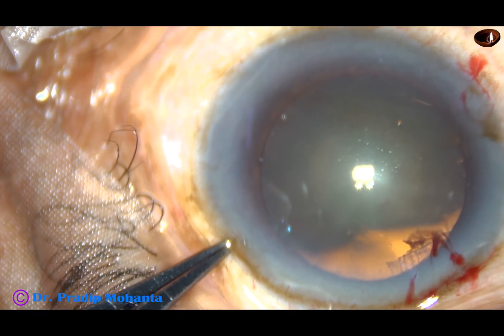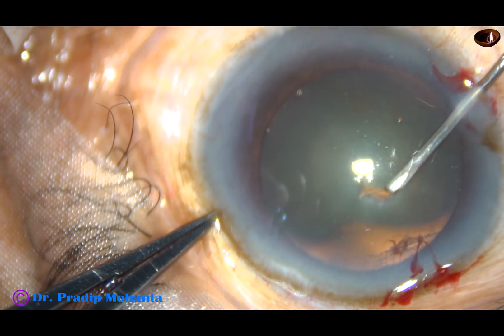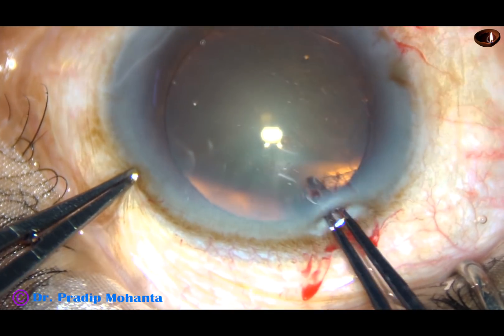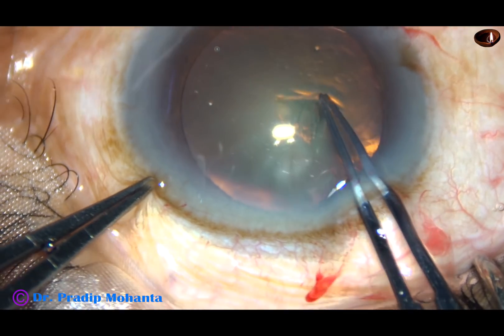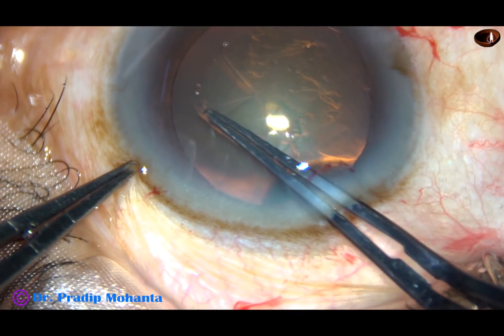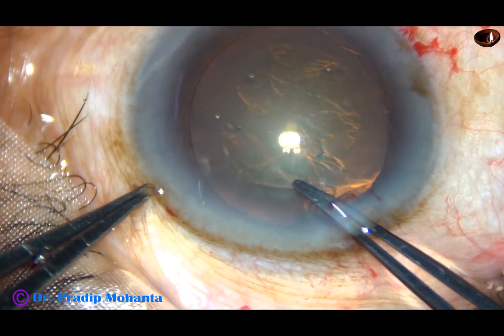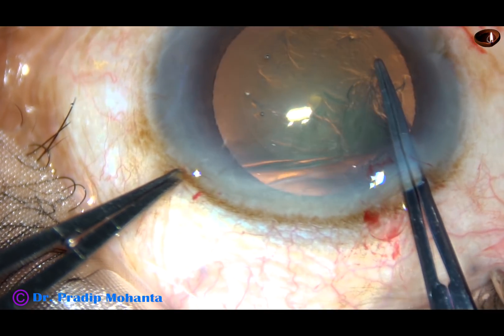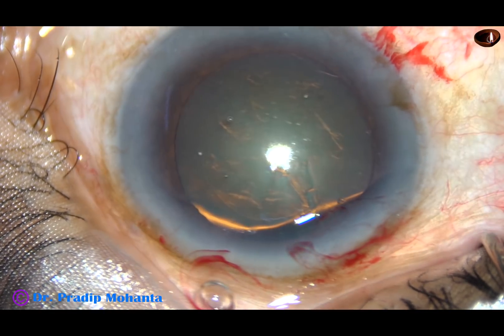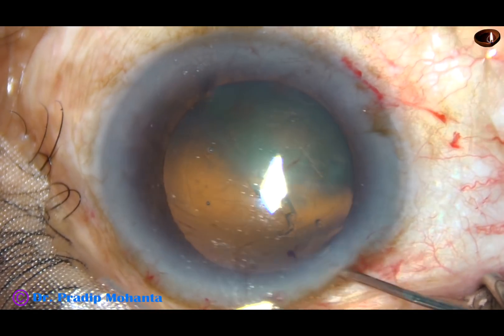Now capsulorhexis. The anterior capsule is incised with a 26-gauge bent needle, a nice capsular flap is raised. I hold this flap with the utrata forceps, guide this flap anti-clockwise and do an optimum sized continuous curvilinear capsulorhexis. In this case, the rhexis size is about 5.5 millimeters.